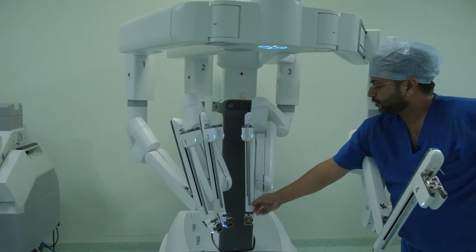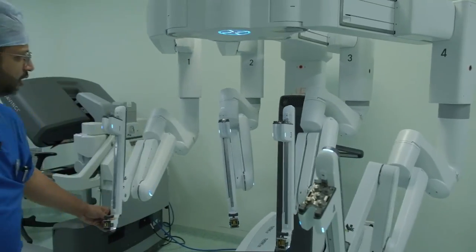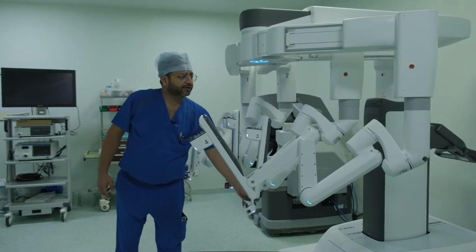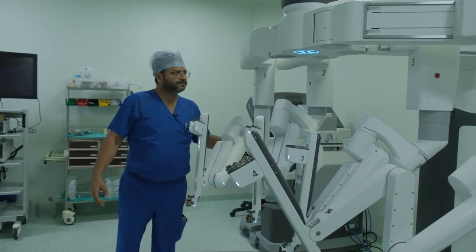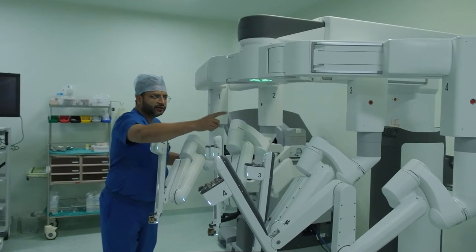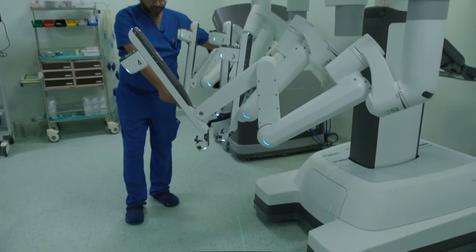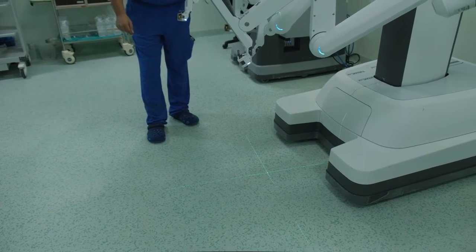Once we bring the arms forward, one of the differences in the Si and Xi, or the latest generation model, is that the docking is simpler and the boom can rotate, so you don't have to bring the patient cart from various sides. Once we press the boom rotation button, it can rotate the entire boom. You can see there is a targeting light here which glows green, and it is pointing down to the endoscope area. So this green cross down there should point to the endoscope area for targeting as well as for docking.